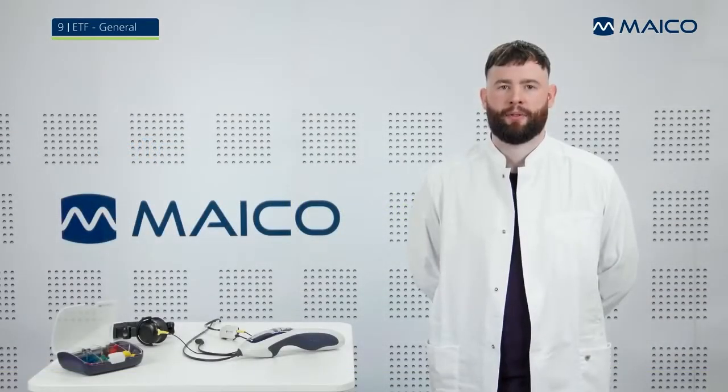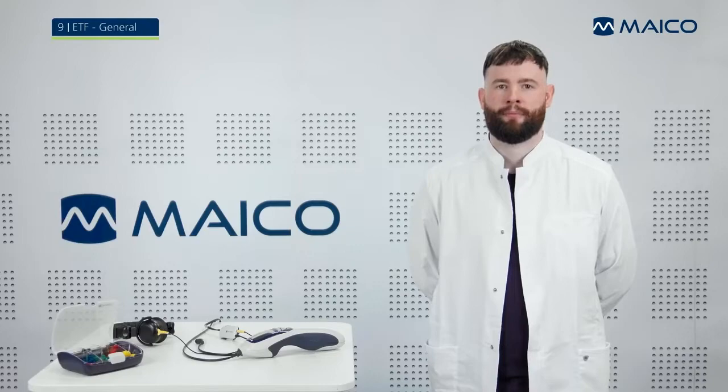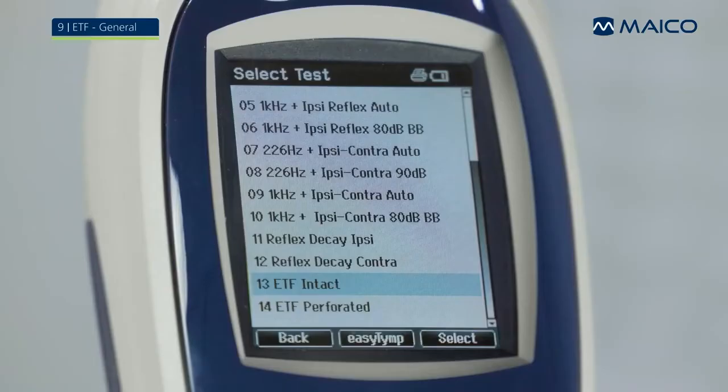The easyTymp Pro includes two protocols to perform measurements of the eustachian tube function. ETF intact is performed on patients with a normal tympanic membrane. ETF perforated is performed on patients with a perforated tympanic membrane or open PE tubes in place. Select the ETF intact or perforated protocol from the Select Test screen.